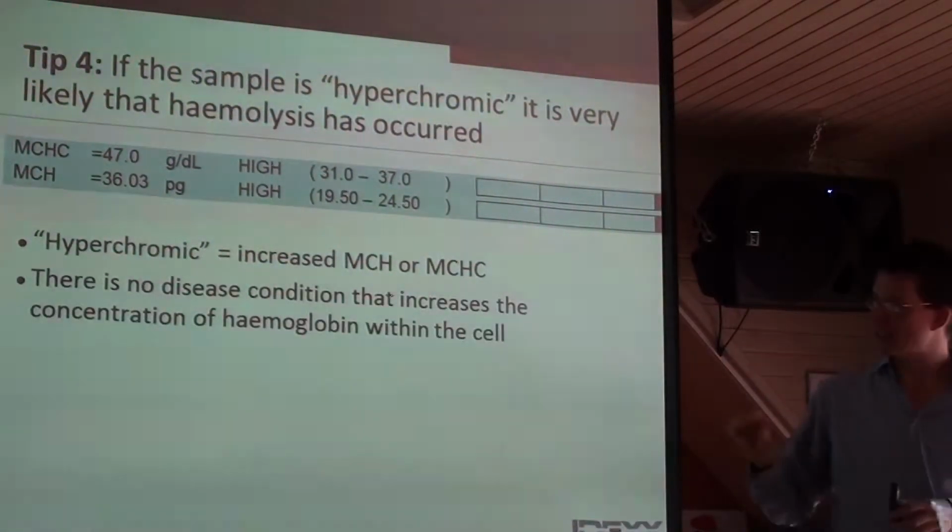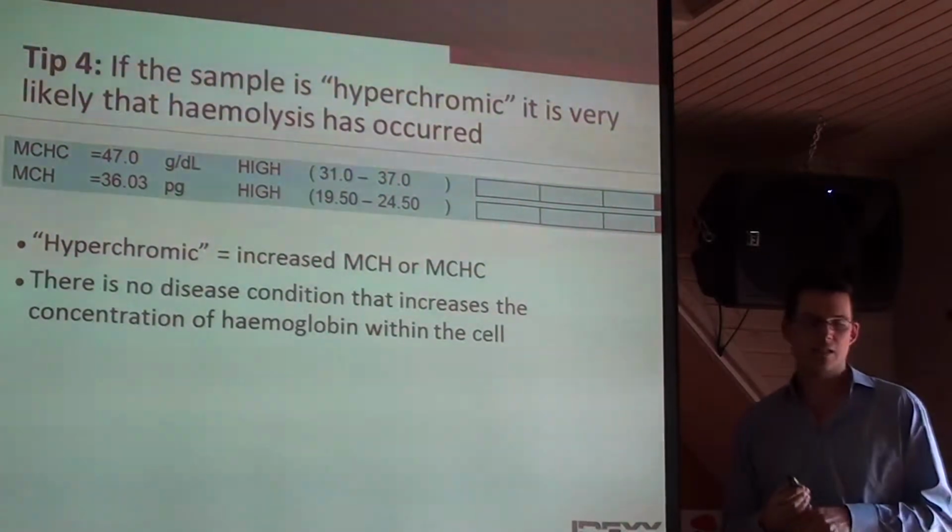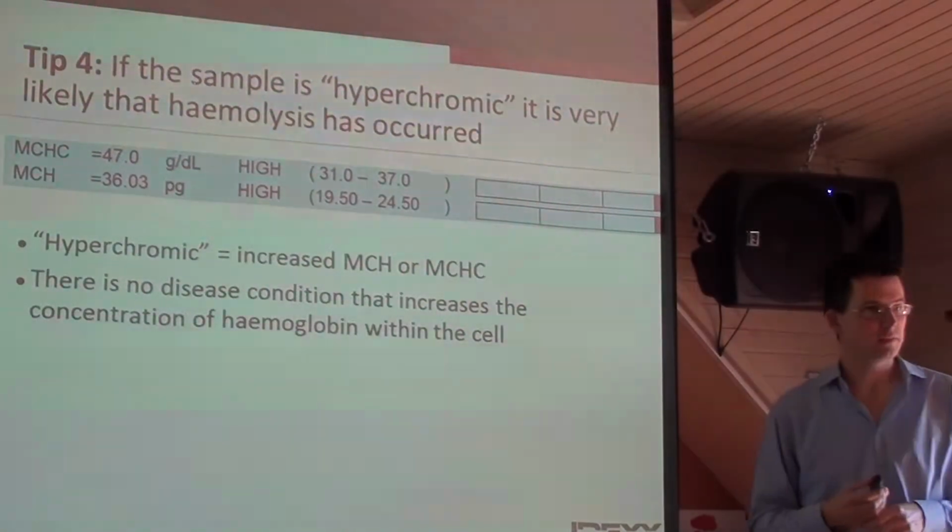There is no disease condition that causes an increase of hemoglobin within the cell.